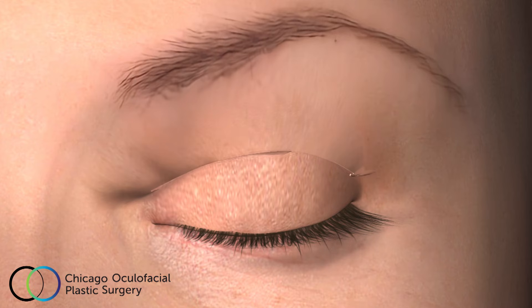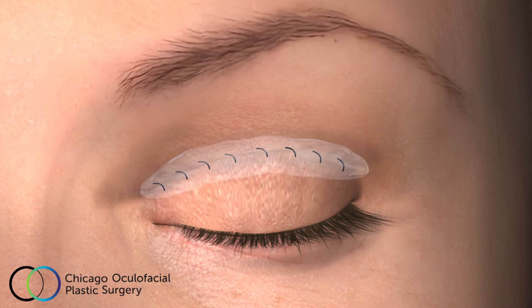Then the eyelid skin is meticulously closed with a running, absorbable suture, leaving a barely perceptible incision line. Finally, antibiotic ointment is placed on the incision sites.